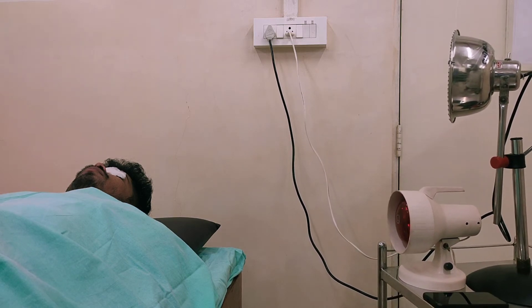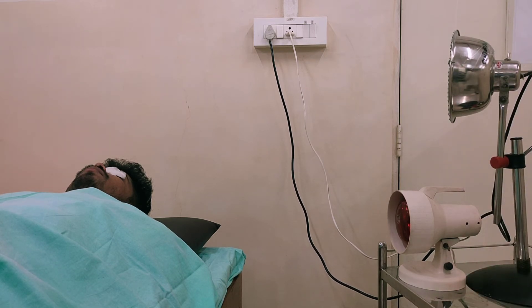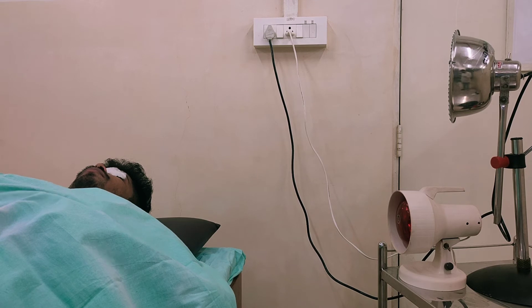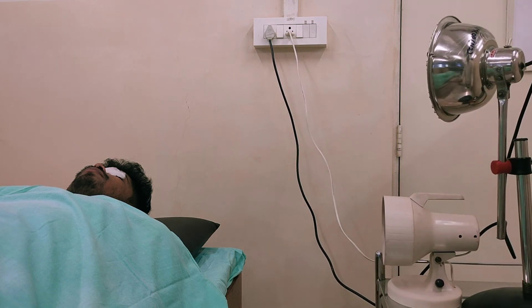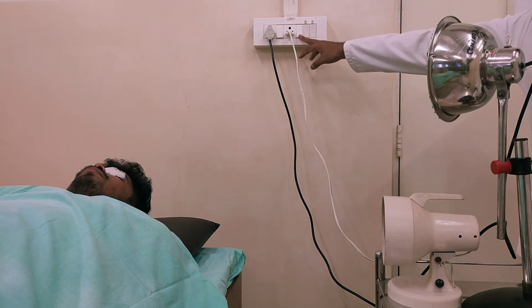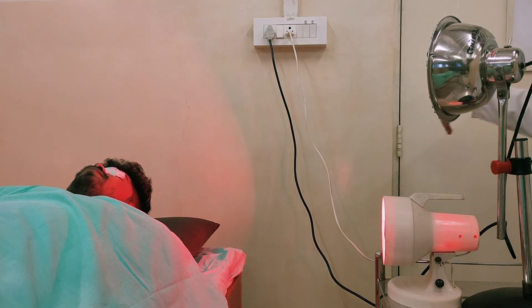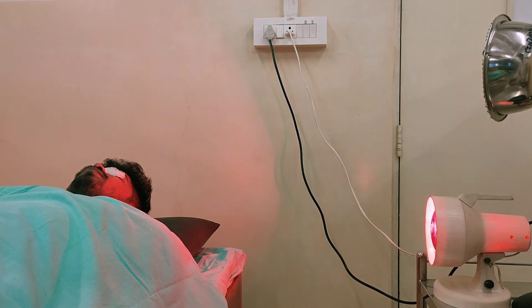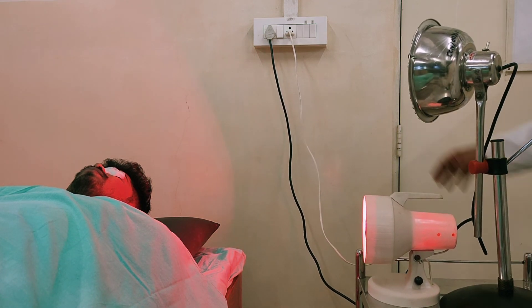Afterwards, check for any listed contraindications, and then you can switch on. After checking local contraindications and sensations, and having explained about the generator to the patient, you can switch on. Whenever the patient complains that he or she is feeling too much heat, you can simply increase the distance between the generator and the body tissue according to the treatment plan. This is the complete procedure for IR application to the face.